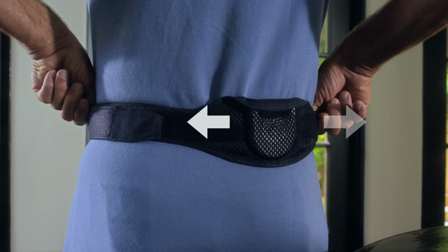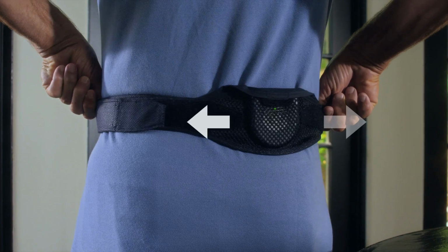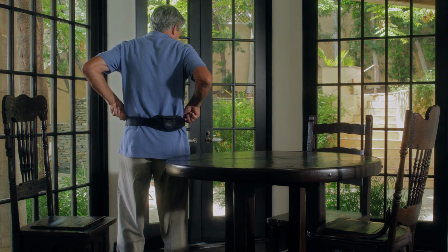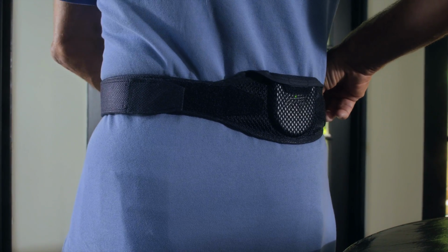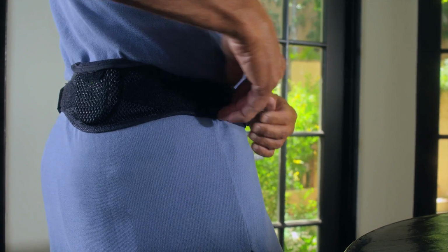Next, move the charger from side to side and listen for the beeping to stop on each side. Once again, move the charger to that midpoint. This is the easiest method when trying to center the charger directly over your stimulator. Remember to tighten the belt once the charger is positioned over the stimulator.